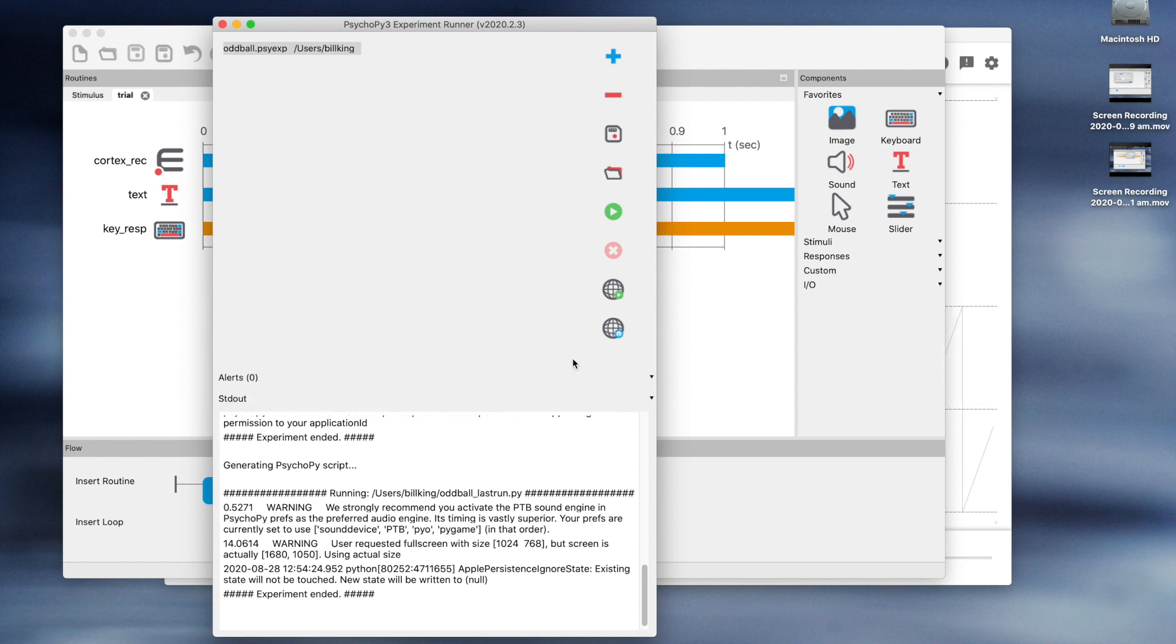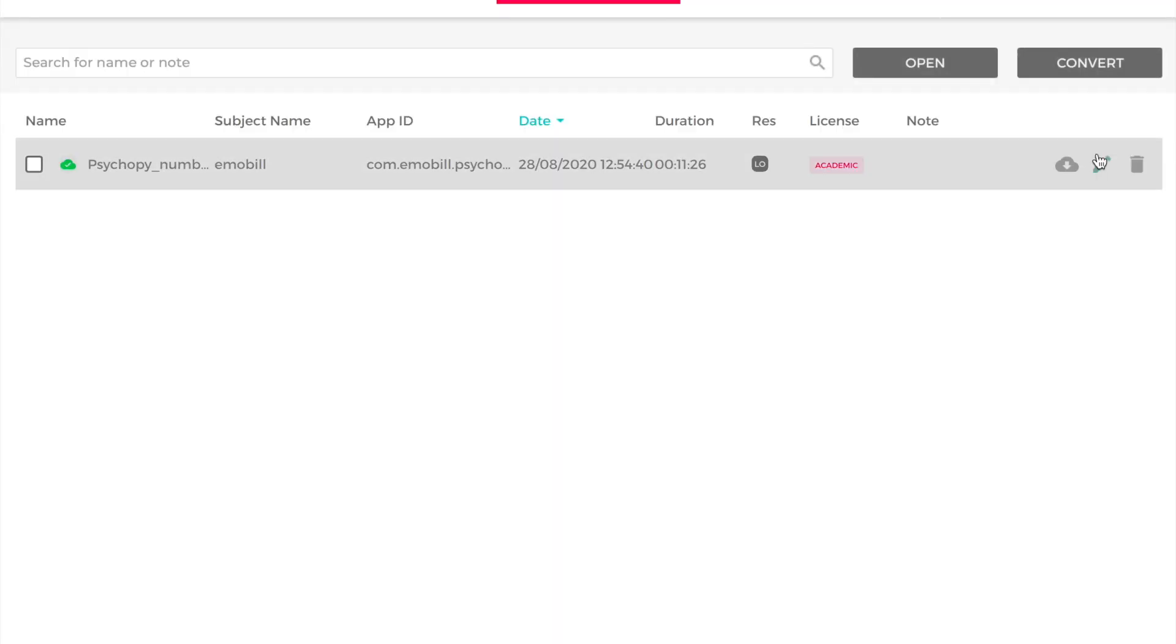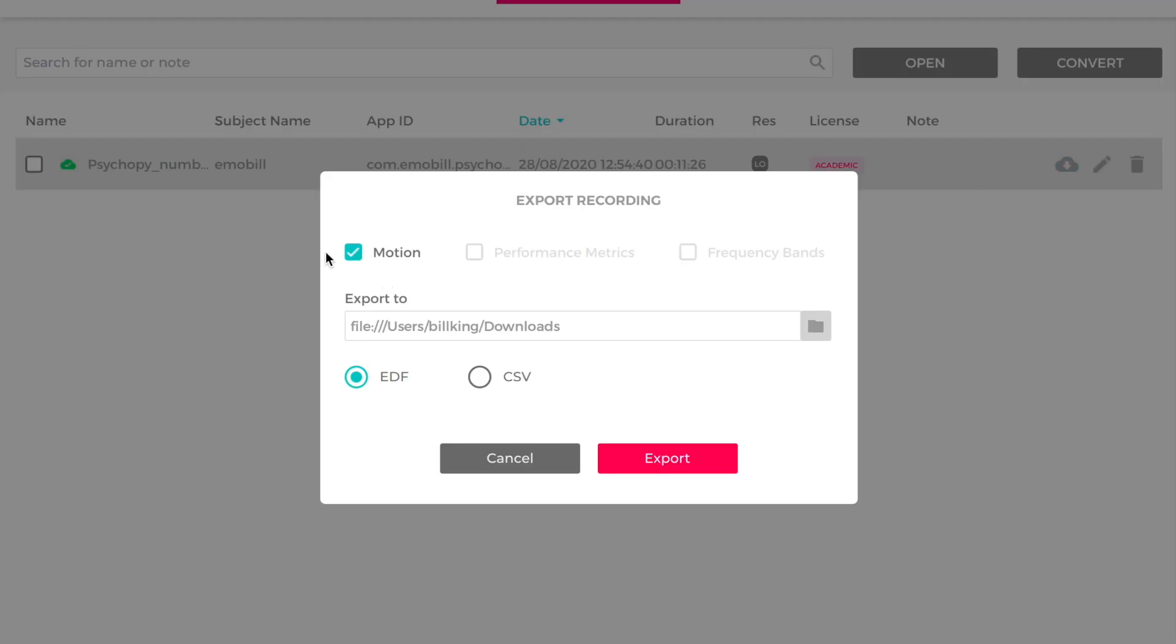So now if we open EMOTIV Pro and look at the recordings, we can see our recording. When you mouse over the record, the action icons will appear on the right. Click on the cloud with an arrow on it to export the record.